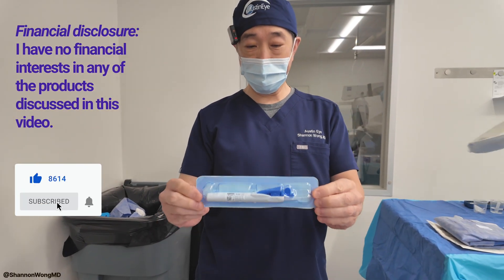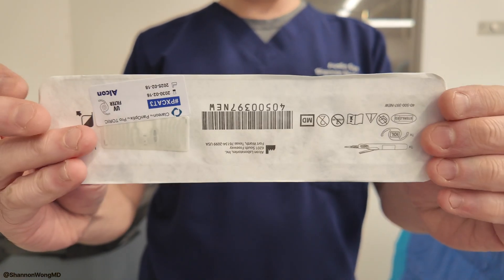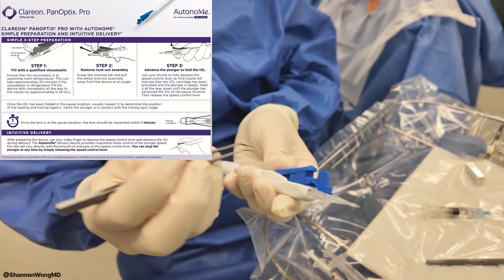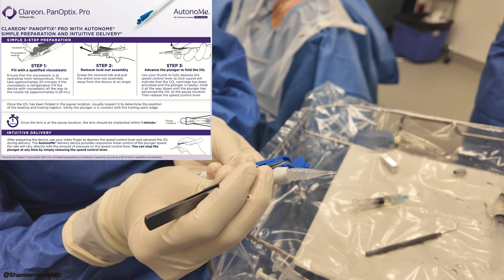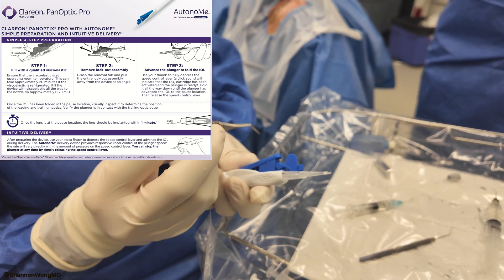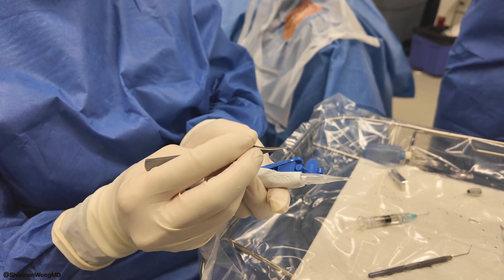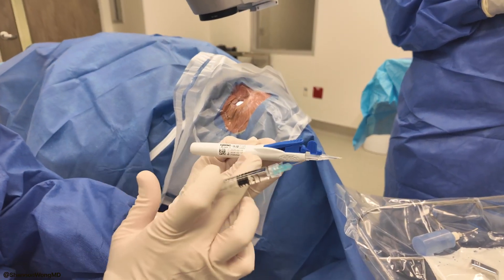So it comes in this little system here. This whole mechanism here is going to come off. This elastic goes in here. The lens is right here. And then this is going to compress this thing from right here to here. This must be a CO2 cartridge in here.